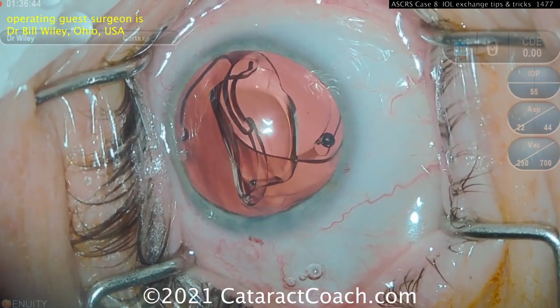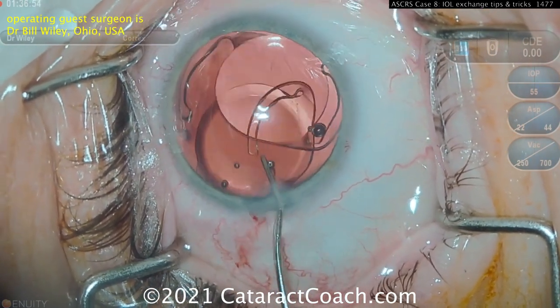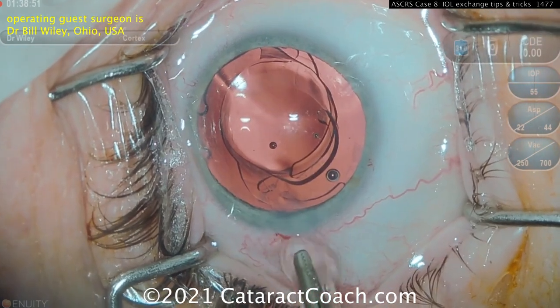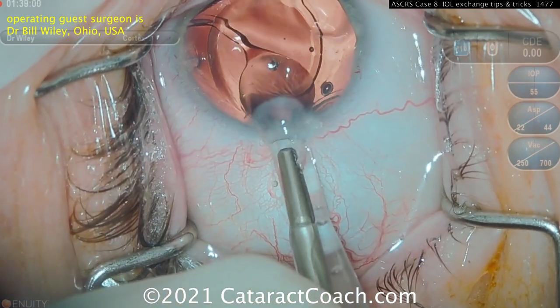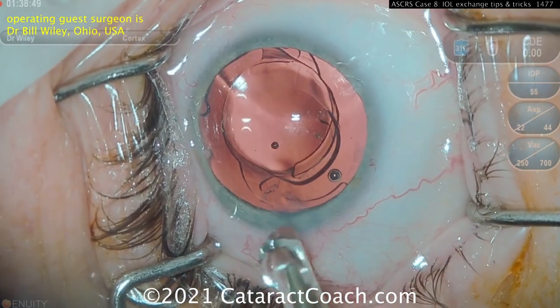The top lens — the one he wants to remove — is handled with something very interesting: the Fukuoka forceps, a long forcep placed in the middle of an empty lens injector cartridge, to grab the lens and pull it into that cartridge. You un-inject the lens just like that, and it works very well.